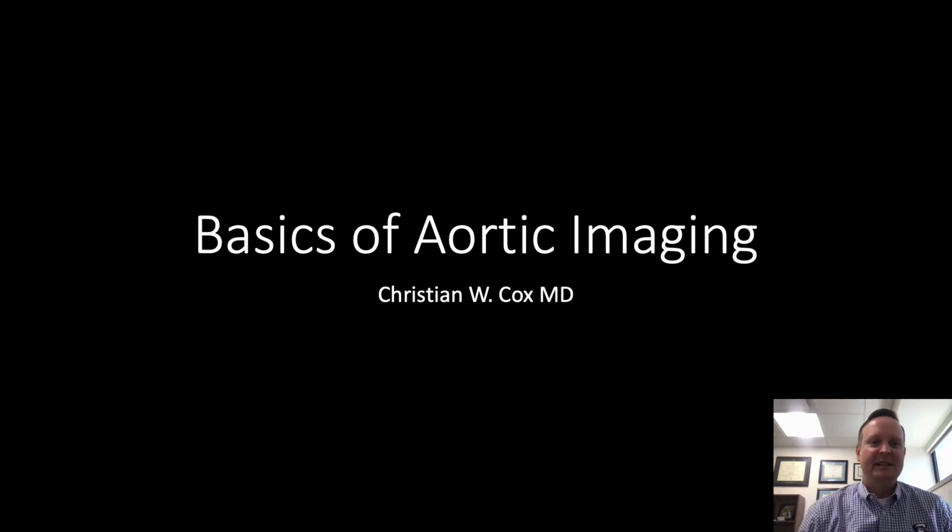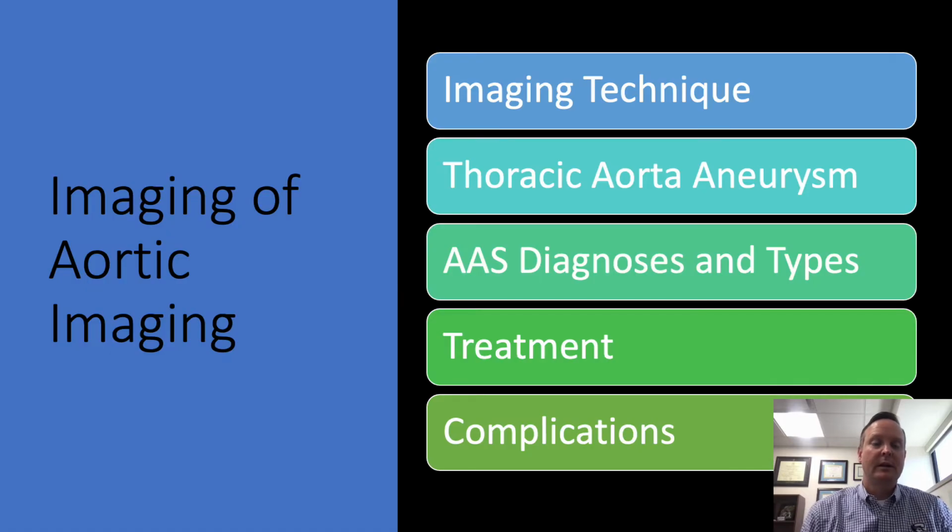Dr. Cox here, and in this session we're going to talk about the basics of aortic imaging. Primary topics that I would like to touch on in this session are satisfactory imaging technique, thoracic aortic aneurysm assessment, acute aortic syndrome along with the different diagnoses and types, treatment, and potential complications associated with acute aortic syndrome.